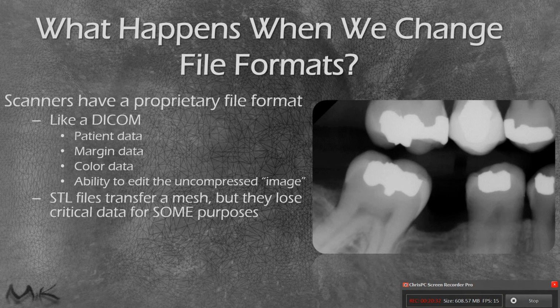So especially for crown and bridge work, if you do a really nice job of drawing your margins, but your scan doesn't have a physical distance between your gingival sulcus and your margin, sometimes you're going to have a hard time trying to reproduce that margin at the dental laboratory.